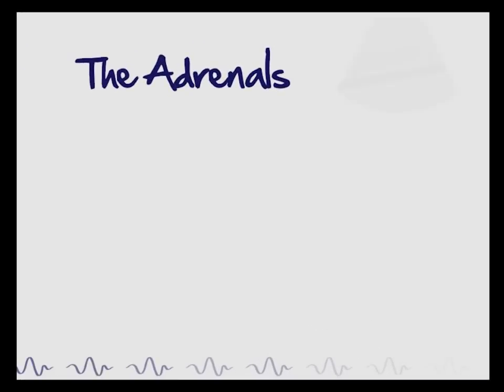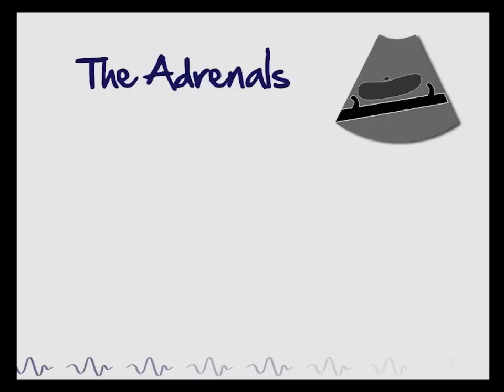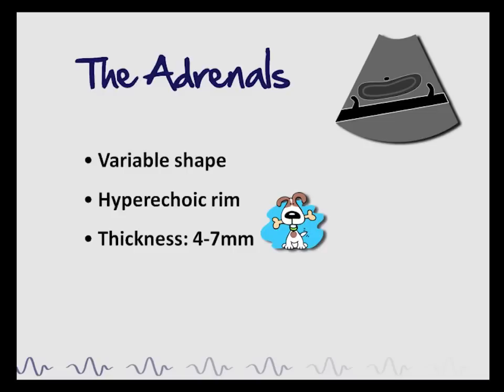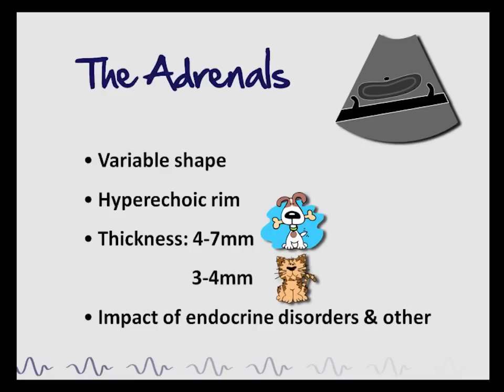The shape of the adrenal glands varies according to the side and image plane used, and can also vary among animals. For example, it is flatter in larger dogs and more rounded in small dogs, and even more rounded in cats. Additionally, a thin hyperechoic rim may be present at the junction between the medulla and cortex in normal dogs. Measurement of its dorsoventral thickness is most representative of its size. Normal adrenal glands vary between 4 and 7 mm in dogs and between 3 and 4 mm in cats. The impact of different types of endocrine and other disorders on the adrenals must be understood when examining these glands and interpreting their size.